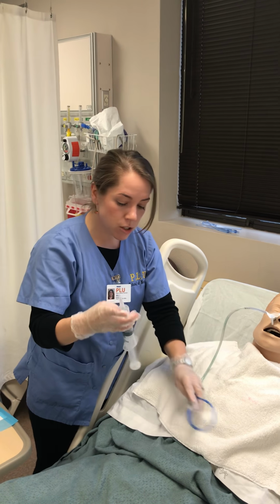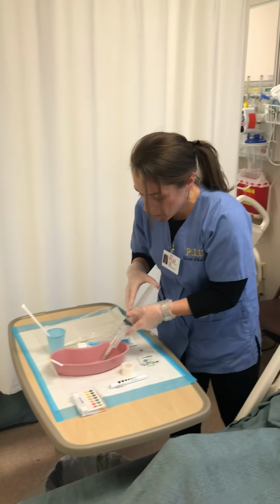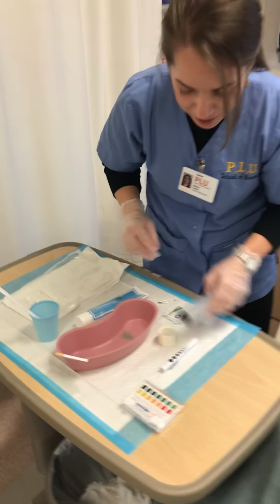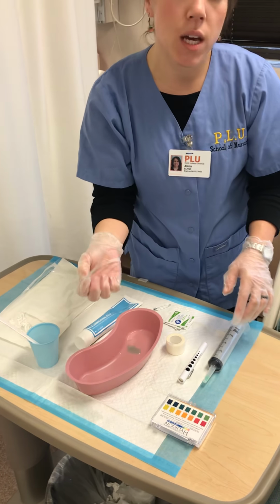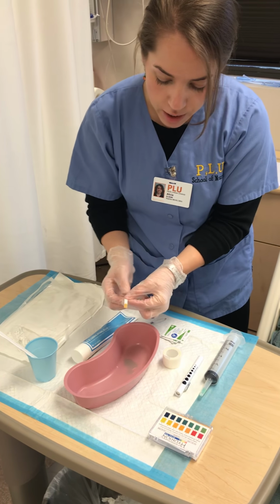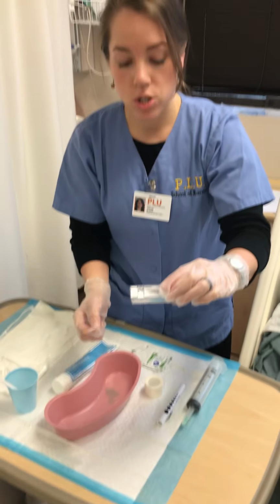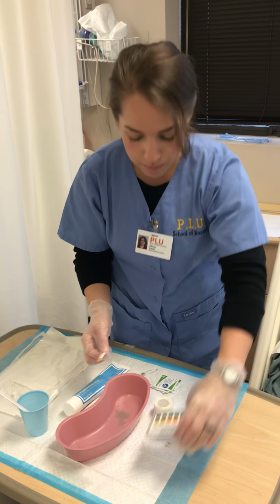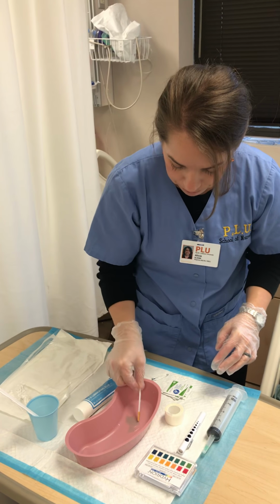And I'm going to check and make sure this is gastric contents by putting a little bit into the emesis basin, just a tiny bit there. And then my pH strip, which I had ready to go, I'm just going to dip in and then pull it out and assess the color with the strip, and I'm at a 4 pH, which is what I would be looking for if I was in the stomach. So I know I'm in the right spot.